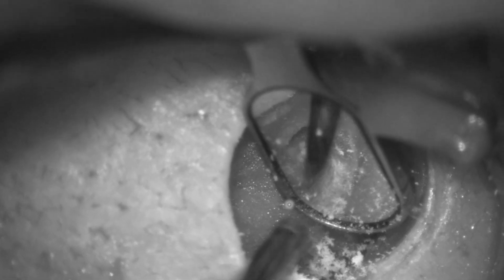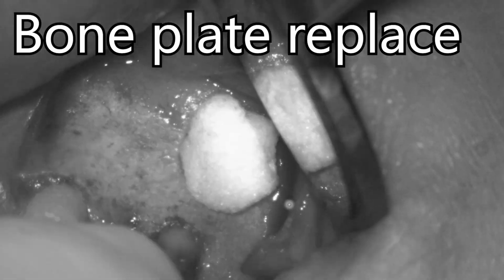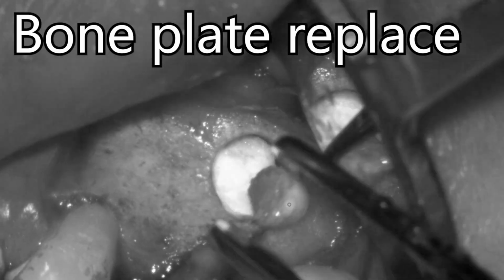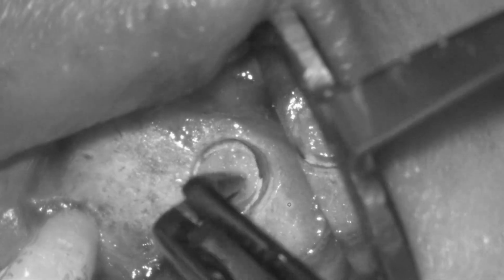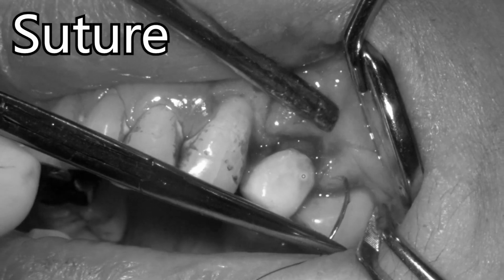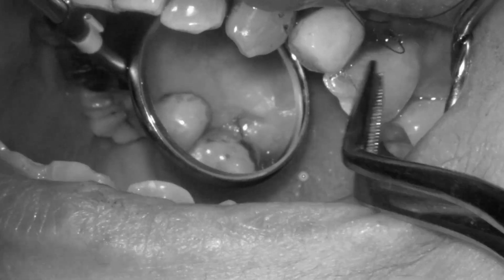We resect the apex. We use the ultrasonic to remove the remaining apex and then clean the remaining canal space. After that, we fill it with MTA, put a little gelfoam here, and put the bone plate back. And we suture it.